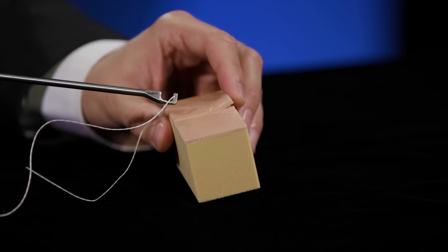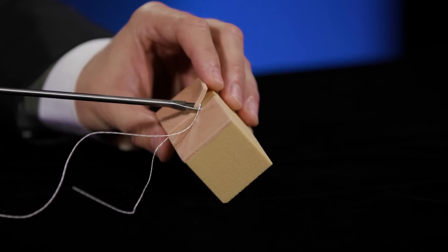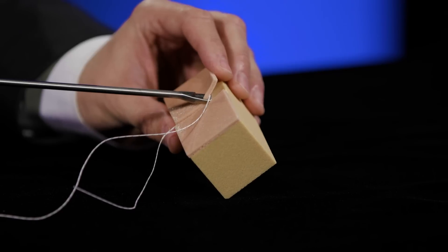You'll slide that through your portal and hook the lower jaw underneath one limb of your tissue. The device, when fully engaged, will give you a 4.5 millimeter bite from the edge of the tissue that you've cut.